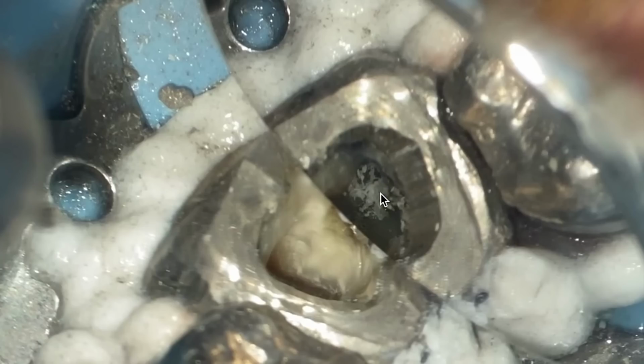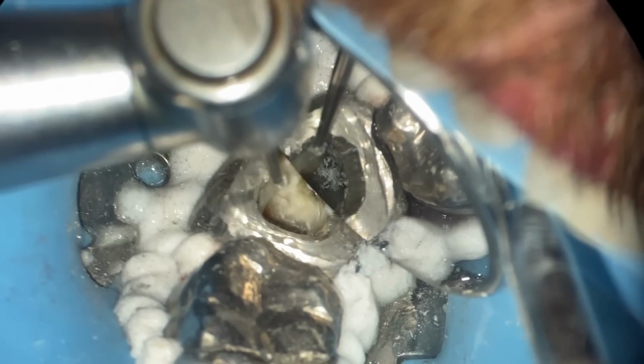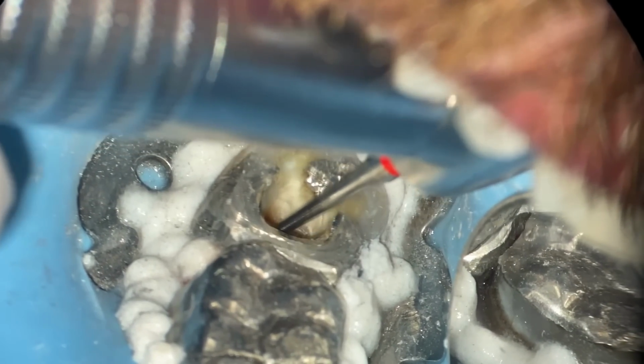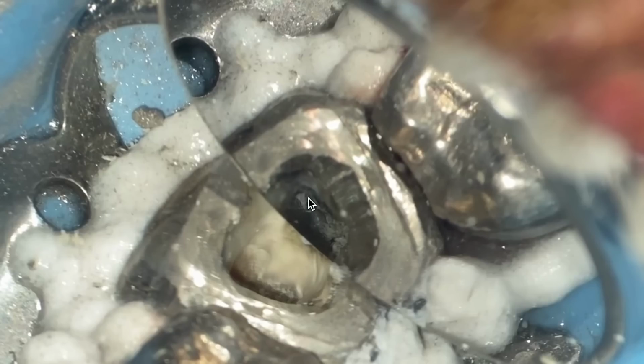And of course, this is just from experience. I've done thousands of teeth, but also a lot of extracted teeth have been very helpful in kind of the feel. So I'll just do a little bit of brushing. So I ran it for maybe 3 to 5 seconds maximum. Then I'll take a look, and now we've opened it up a little bit more.